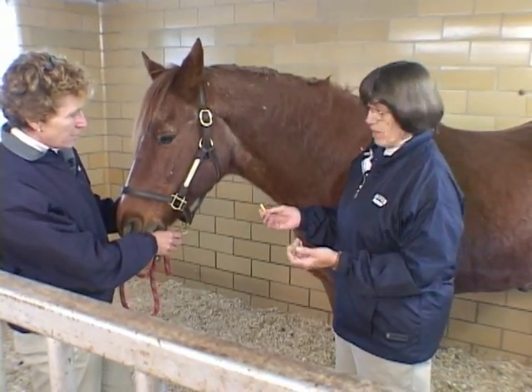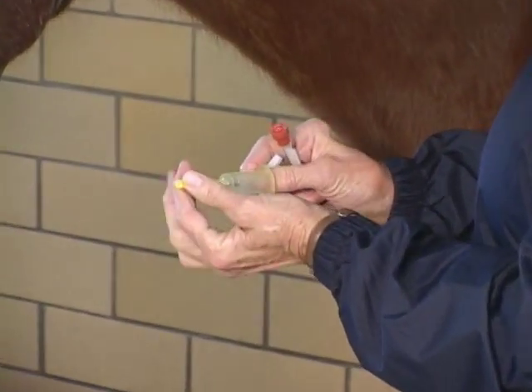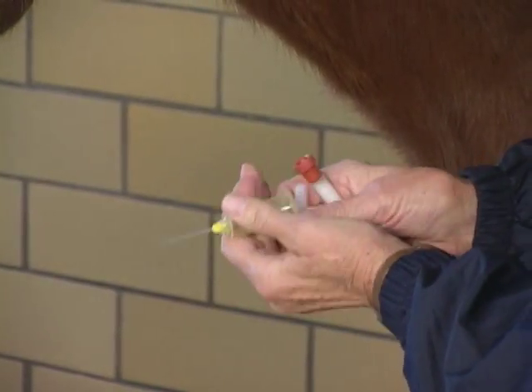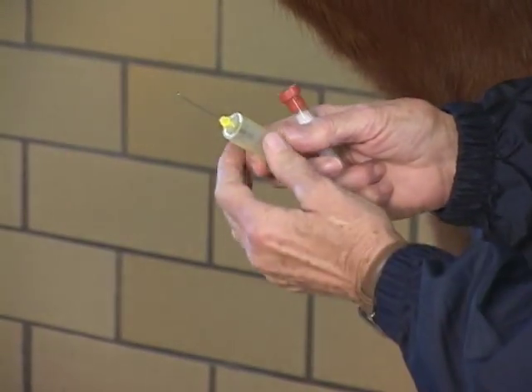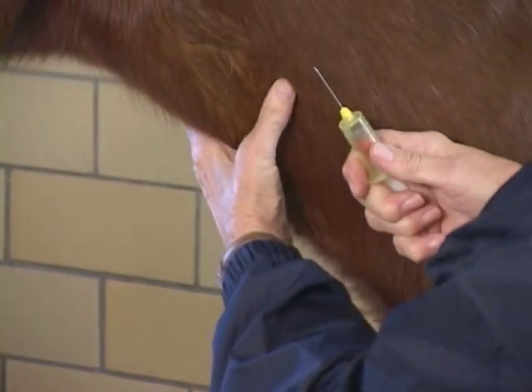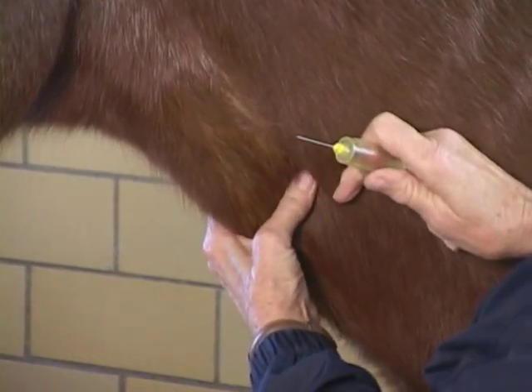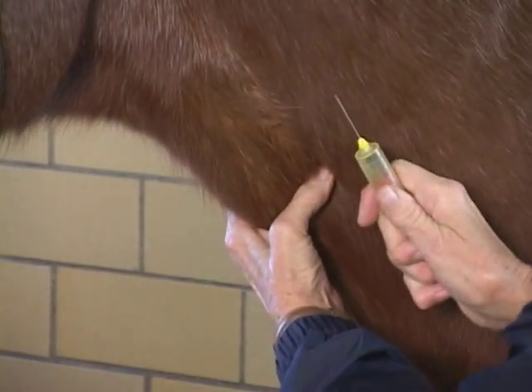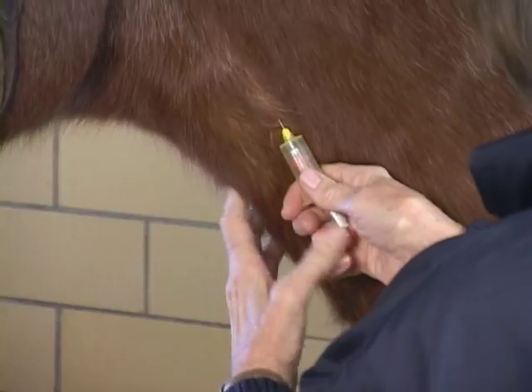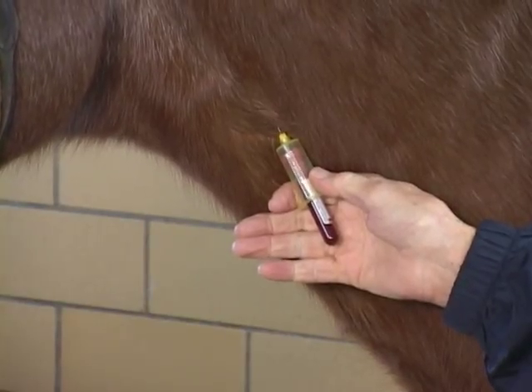I'm going to take blood with a vacutainer system here to start with. As we showed you before, you're going to put the holder onto the needle and screw it on tight. This is designed to take the tube in like that. I will build his jugular vein up — you can see it real well. I like to have my needle with the bevel toward me. And you can see the blood filling that tube.